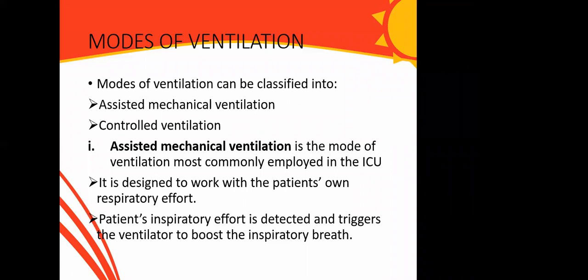The idea is that it is designed to work with the patient's own respiratory effort. The patient continues to make some form of respiratory effort throughout the support. In this mode, the patient's inspiratory effort, no matter how little, is detected, and this is what triggers the mechanical device to boost the inspiratory breath.